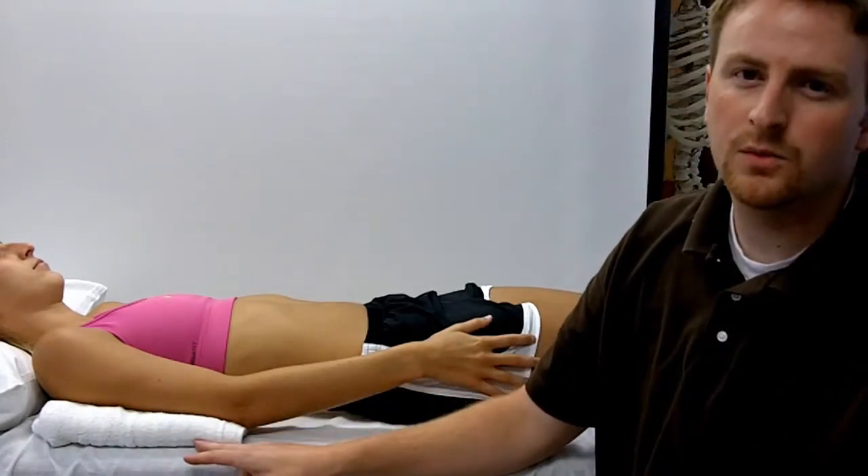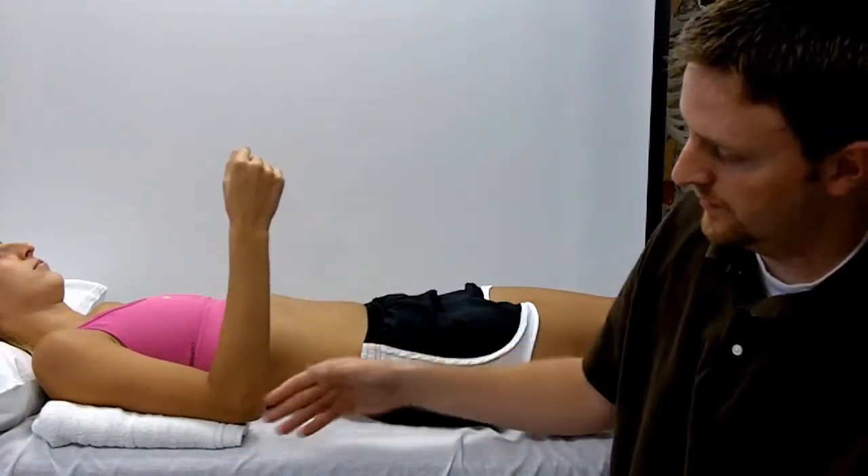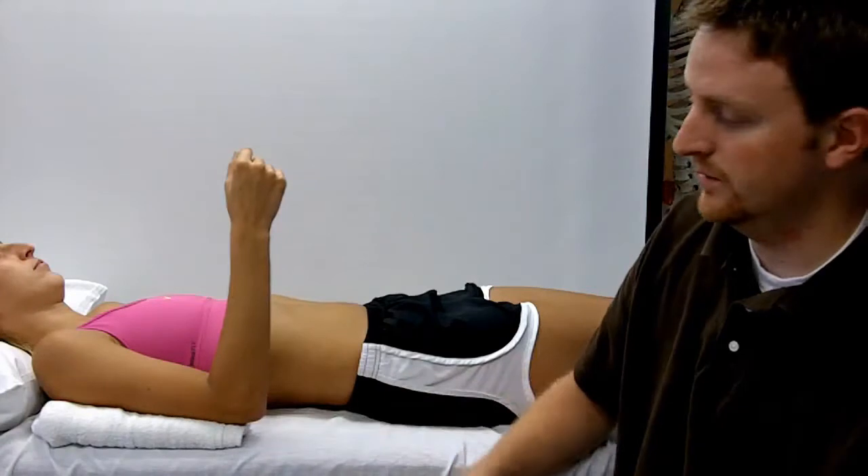You're going to want to place a towel underneath the humerus of the patient. This is in order to lift the elbow off the table so that you can place your goniometer there and get an accurate reading.